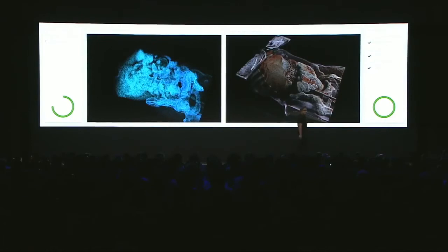This doesn't assume a particular model that computes an X-ray model called the Radon model. This iterative reconstruction method, one beam at a time, calculates, estimates, and corrects, and over time creates this. It's essentially the ray tracing, if you will, of medical imaging. And it computationally is several hundred times more than the traditional method. This is what's inside today's CT machines, except for the latest generation ones. The vast majority of the world's CT machines are like this. If we could use this technique, iterative reconstruction, we could reduce the dosage of X-ray tremendously while increasing the resolution and fidelity of the reconstruction.